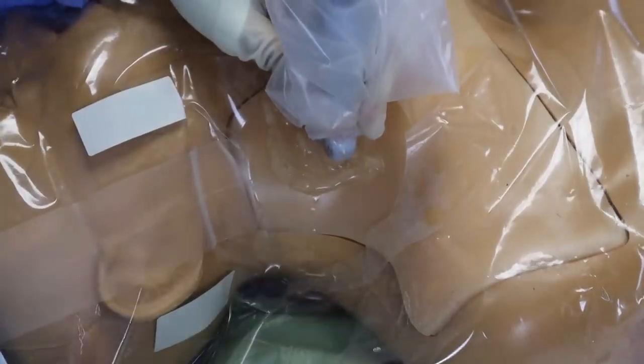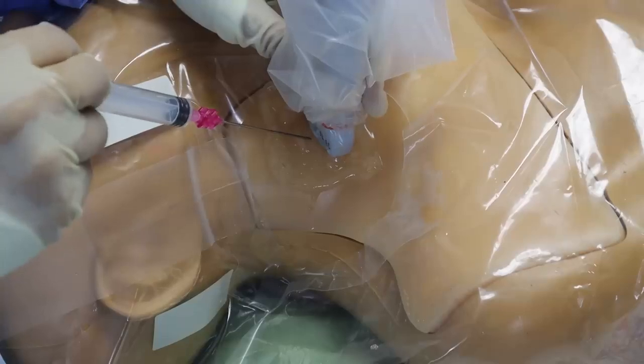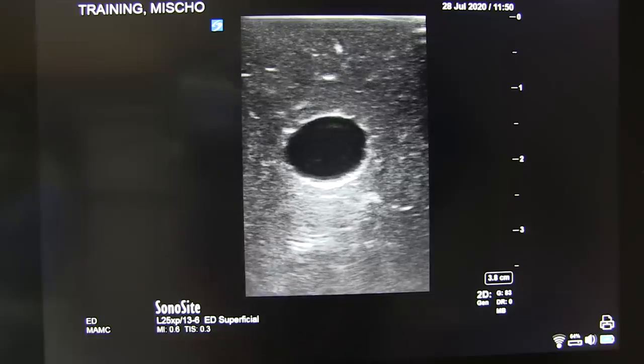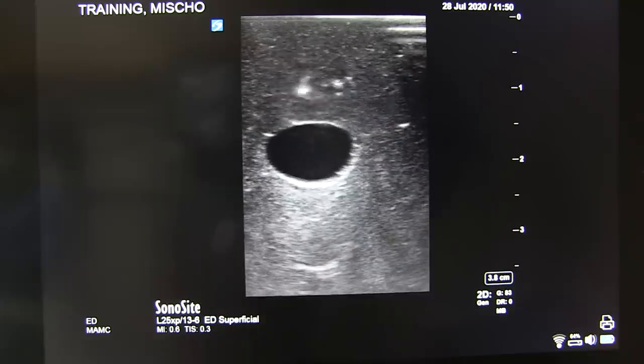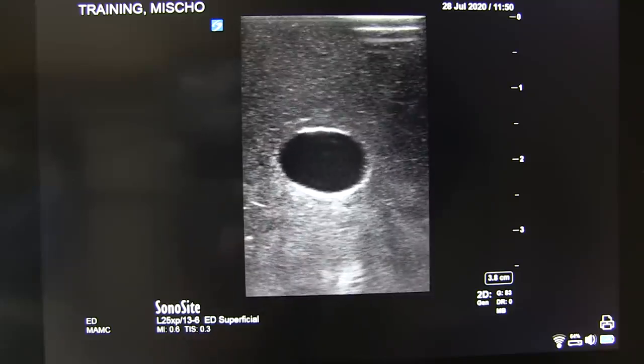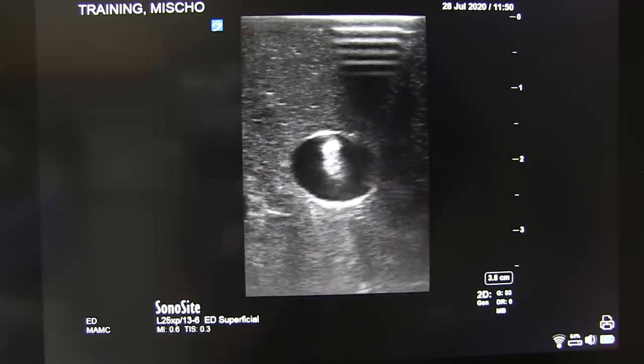Place the ultrasound back on target and then wield the finder needle. Use the ultrasound to guide the finder needle into the lumen of the jugular, applying negative suction pressure on the syringe as you advance it. I cover the ins and outs of ultrasound guided access in this other video which I'll link here. You should definitely watch it now if you haven't already. And once you're done, come back to this video.